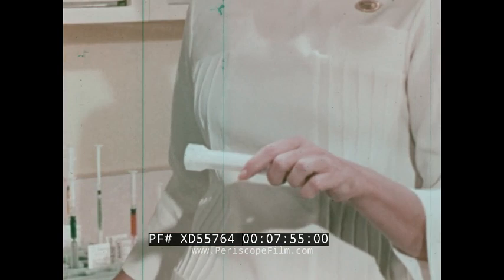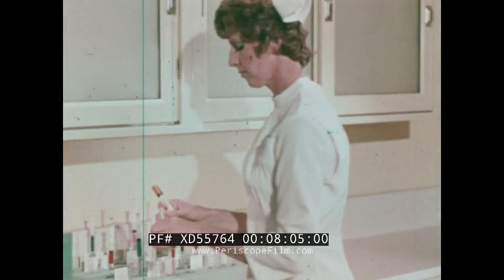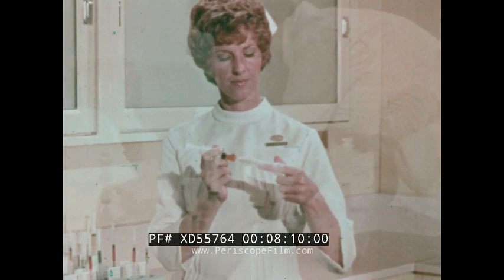Safety to yourself in the area of responsibility: each time you open a Monoject unit, you assure yourself that it is sterile. In the area of patient safety, the use of the sterile platform technique assures there will be no contamination of the needle after drawing medication and returning to the sheath for delivery.